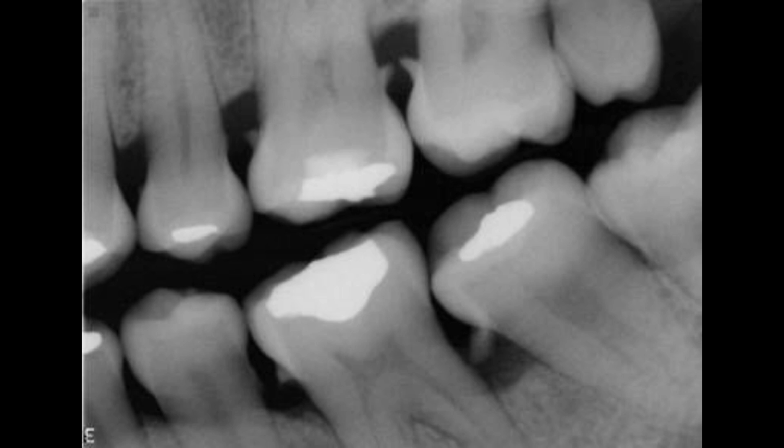If you look between, what would that be, 19 and 20, there's vertical bone loss. You can see how it's going down the side of the mesial of 19. And then there's horizontal bone loss on the maxilla, there between 12, 13, 13, 14, 14, 15. And we see those vertical defects on the mandible. So that's the difference there between horizontal bone loss and vertical bone loss.